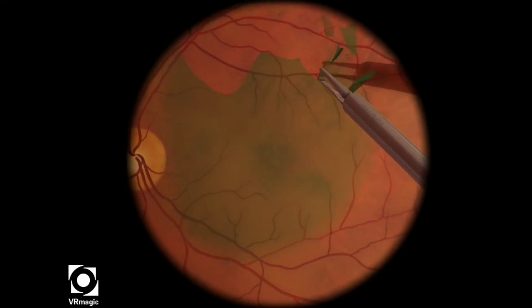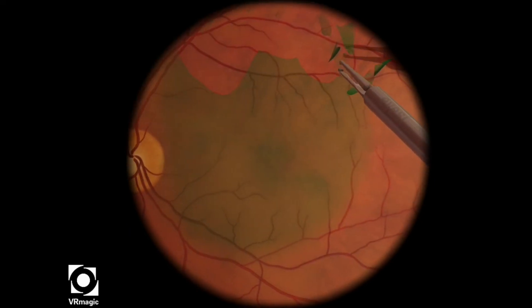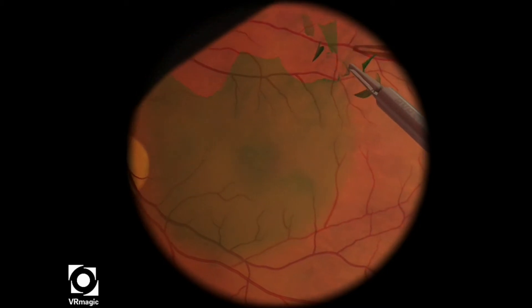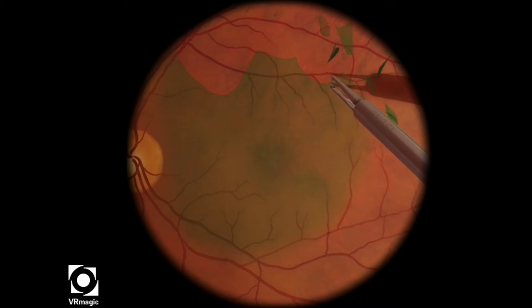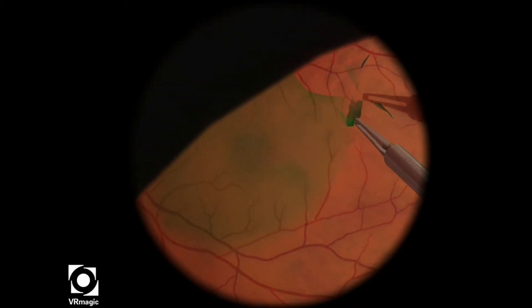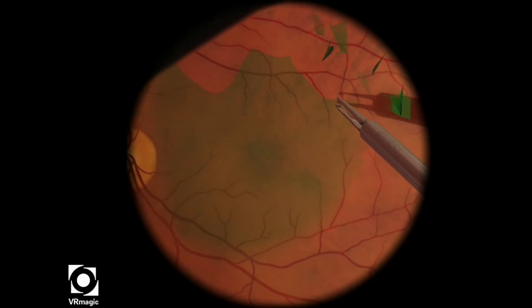Again, small little pieces are coming off. Remember just to grab the tip or the edge of the peel and try not to touch the retina as much as possible. After I've done that particular area, I'm getting a little bit closer to the macula, just slowly peeling piece by piece.